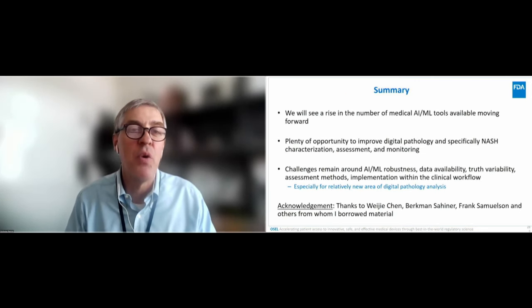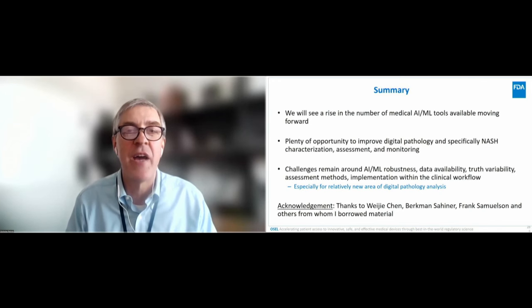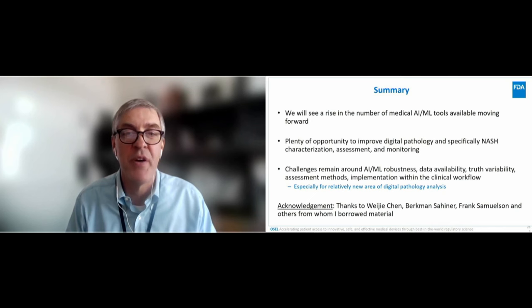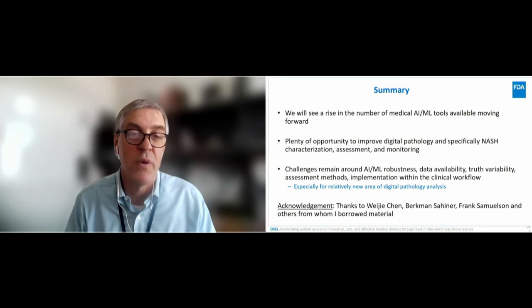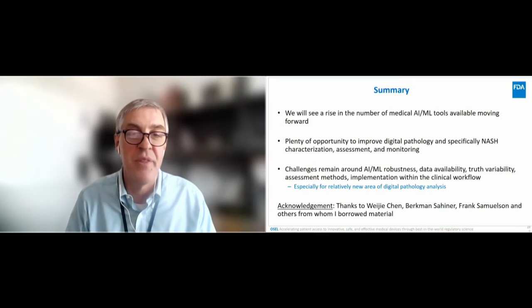And just in summary, we will see a rise in the number of medical AI/ML tools available moving forward. There are plenty of opportunities to improve digital pathology and specifically NASH characterization, assessment, and monitoring. But challenges remain around AI/ML robustness, data availability, truth variability, assessment method development, and implementation within the clinical workflow, especially for the relatively new area of digital pathology analysis.